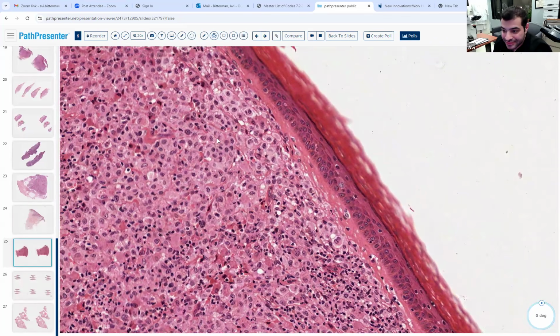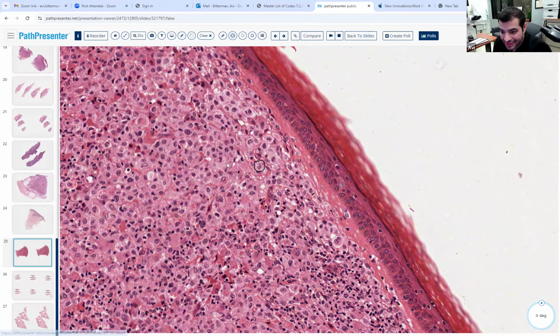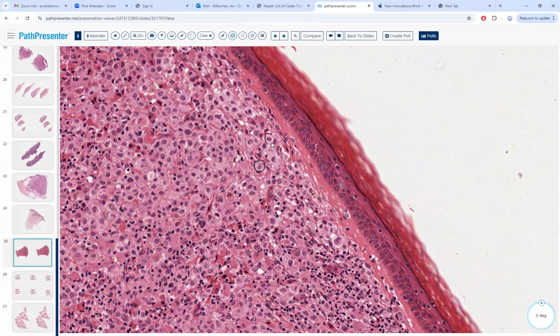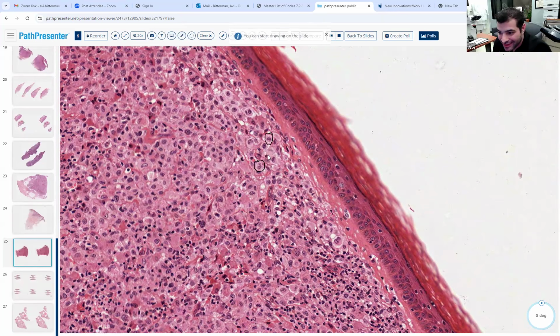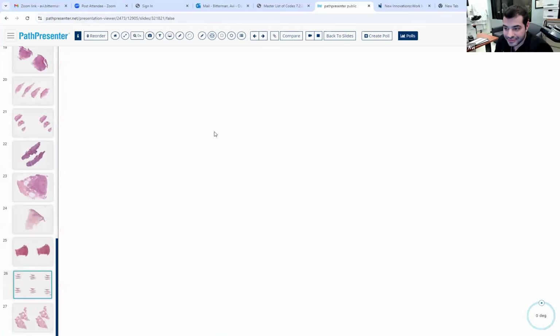And what kind of cells are they? Histiocytes. Are they Langerhans cells? Yeah, what gave you the clue about that? They look like horseshoes, coffee beans, kidney beans. Reniform. Okay, how's this going to stain? Positive for CD1a, positive for CD207, positive for CD68, and positive for S100. Okay, good.